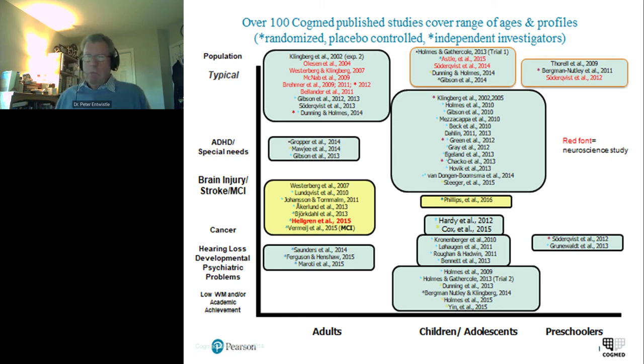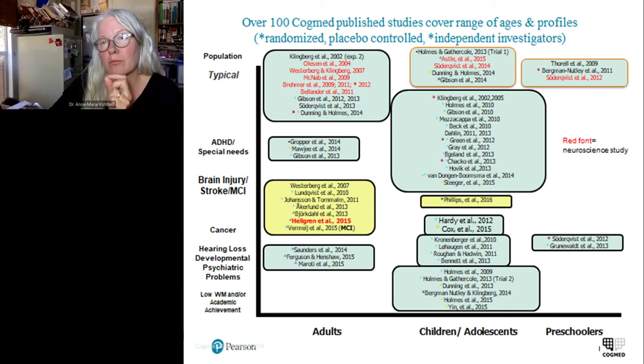There is one, thank you. The other one I'm going to give a quick answer to, and then let you answer about Cogmed, and that is, are there training profiles that allow clinicians to familiarize with the program? I think it was probably about Cogmed, but just in case, I want to say that there's not specific training profiles for RehaCom, but because of the way the program is structured, you're able to create a sample client and run through whatever you want to. So you absolutely are able to familiarize with the program before using it for RehaCom.